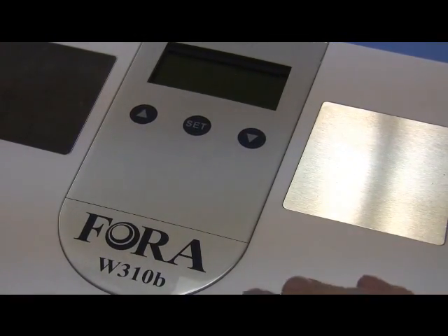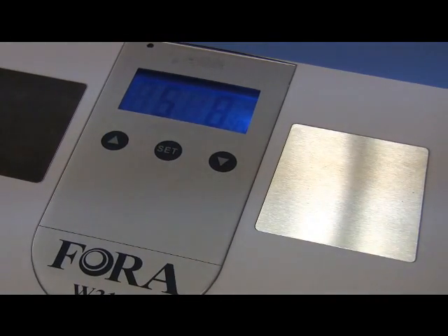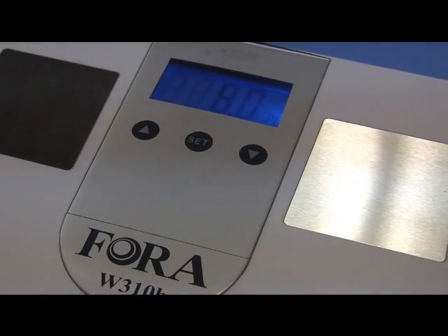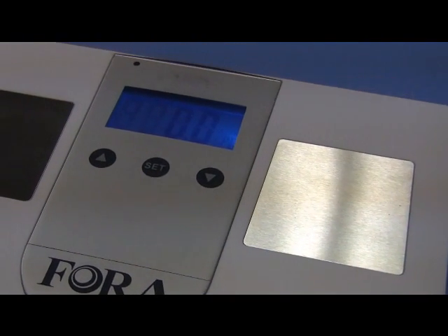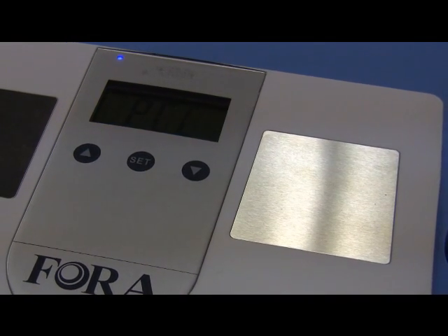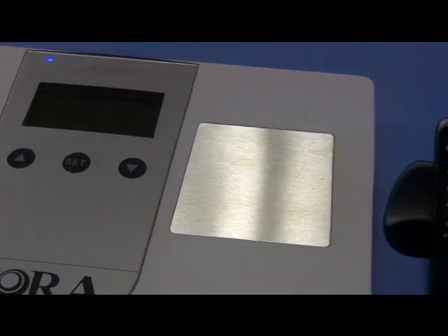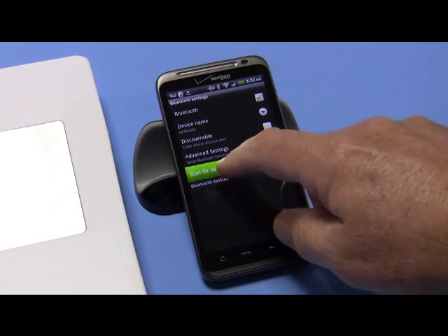Turn the scale on and let it go through. I'm not going to weigh anything. You see the scale up there — zero zero — it's trying to weigh, and then it's going to go into Bluetooth mode. Okay, so it's now trying to communicate with the phone. Let's go back to this and scan for devices.